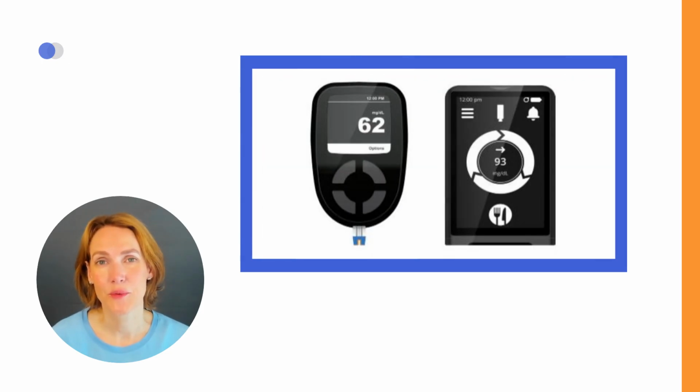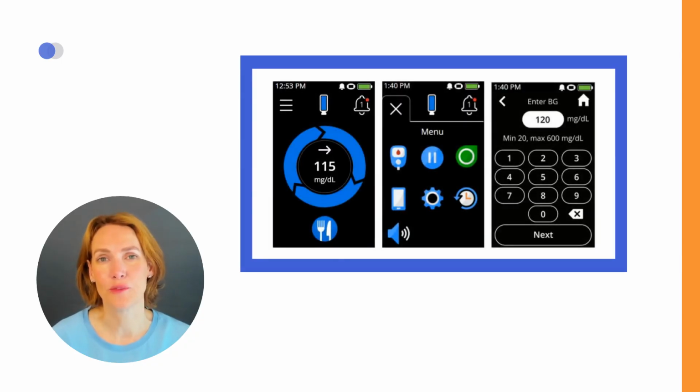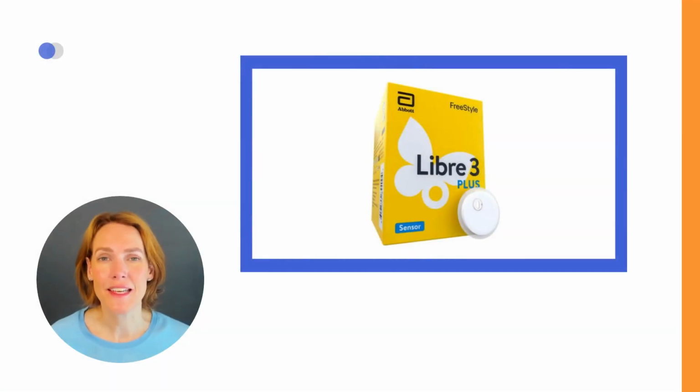If there is a significant discrepancy between the sensor glucose reading and your finger prick result, you may consider calibrating your Dexcom sensor. You can do this via the Dexcom app or via the iLet device itself. However, it is important to perform calibration only when your blood glucose levels have been stable and within your target range for the past few minutes. Calibrating under these conditions helps ensure more accurate sensor readings and enhances the overall performance of the automated insulin delivery system. The Freestyle Libre 3 Plus sensors are factory calibrated and manual calibration is not required.